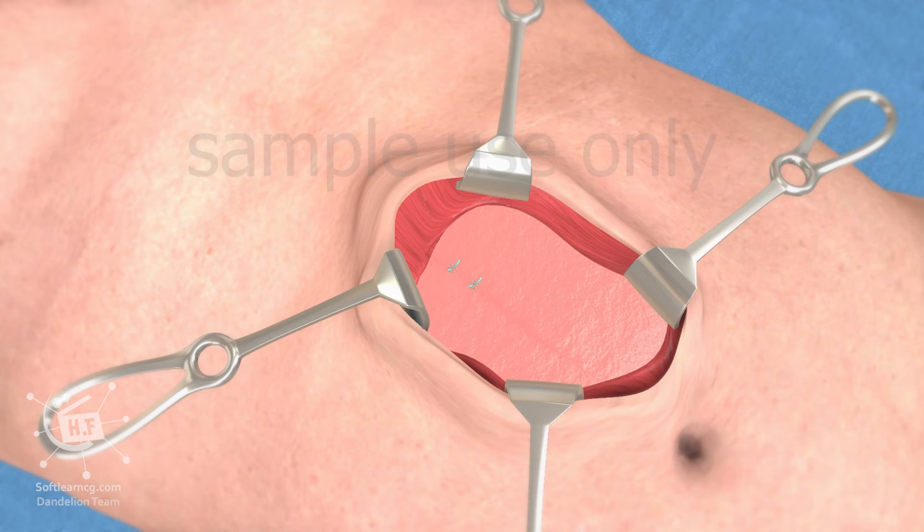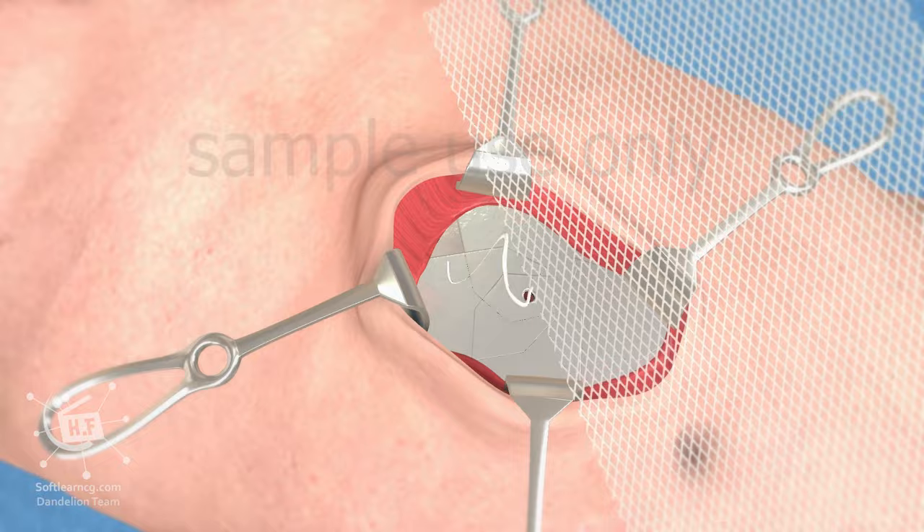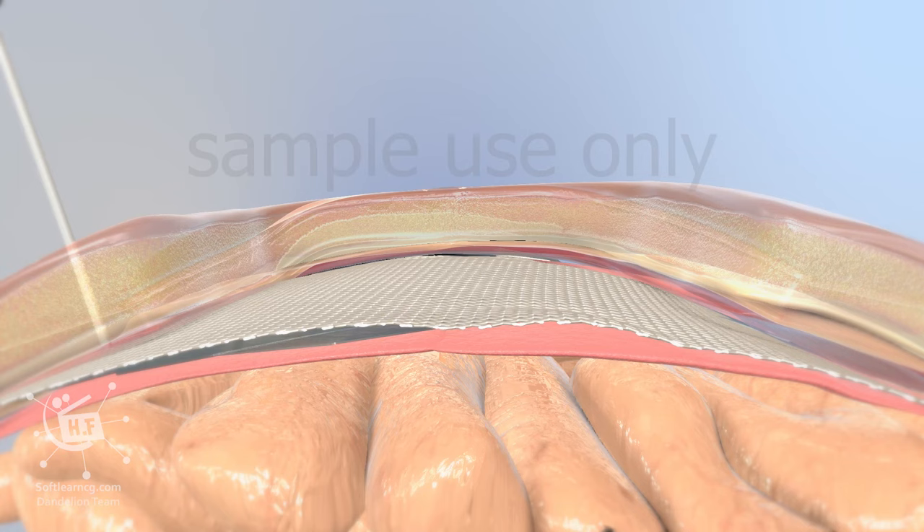Our approach mitigates the chances of these complications occurring. This is accomplished using our newly developed foldable retractor. This device is easily placed within the surgical space, before the mesh is inserted.